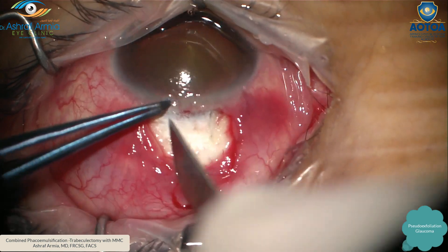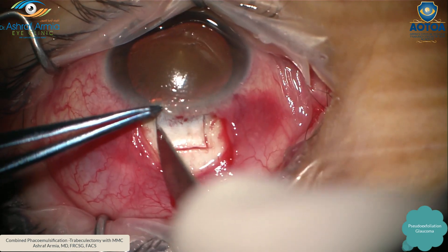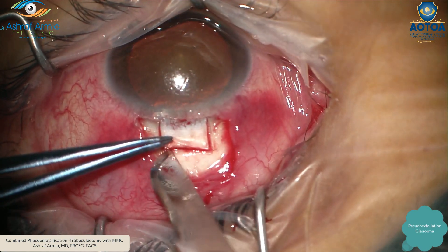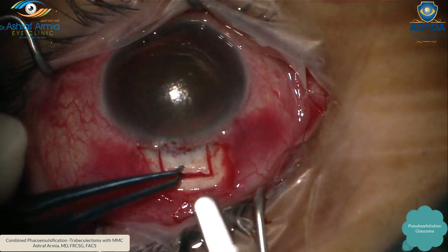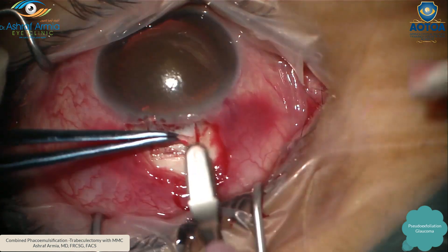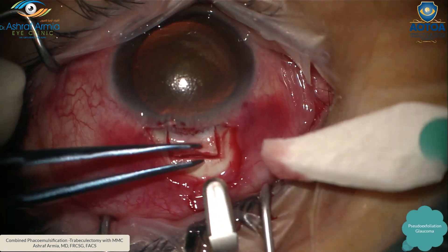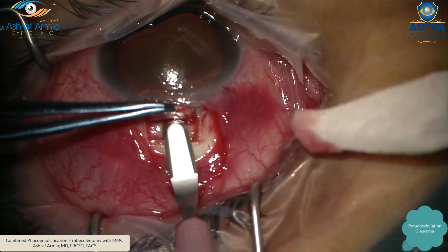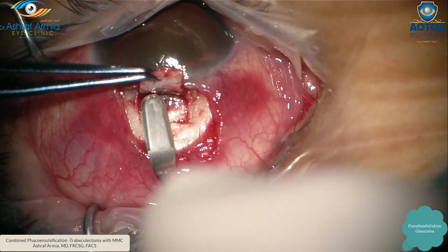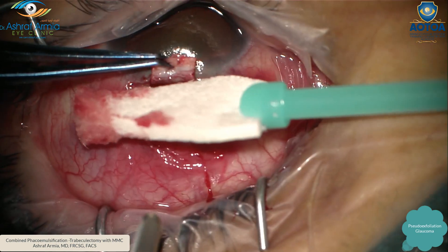Then you do your flap. I do a rectangle flap — the right side and the left side, deep enough. This is very important. Then with the blade you have a lip of the scleral flap, then with a super crescent you go under the flap in the same thickness — a good thickness, not a thin flap and not a deep flap — and you dissect in the same plane.